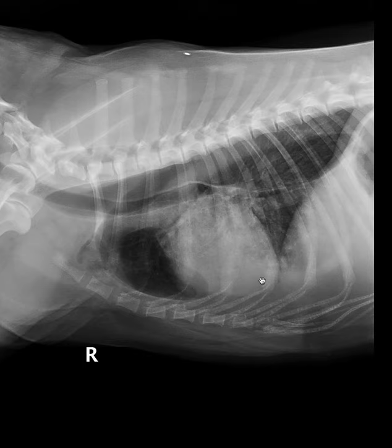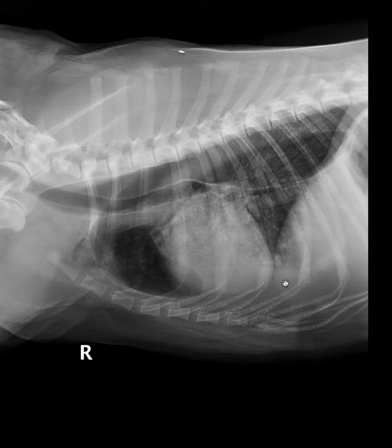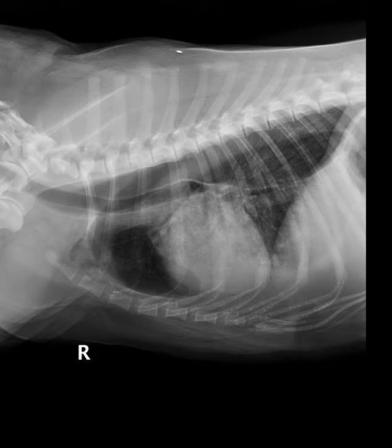The general categories of esophageal disease are structural pathology like a stricture or functional pathology such as a dysmotility disorder. Some conditions like esophagitis could cause both functional and structural issues, so there is certainly some overlap. Generally speaking, when we're talking about plain radiographs, we're looking for structural changes or changes in esophageal size. We can't often comment about the functional aspect of the esophagus with plain radiographs unless we do an esophagram. Esophagography is excellent if available with fluoroscopy. It can also be done with plain radiographs by making serial radiographs, but this can be quite cumbersome in practice.